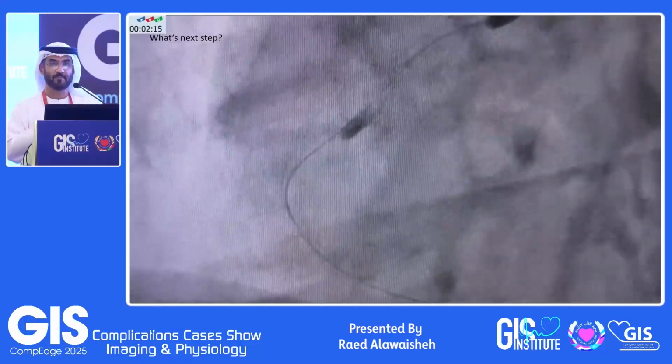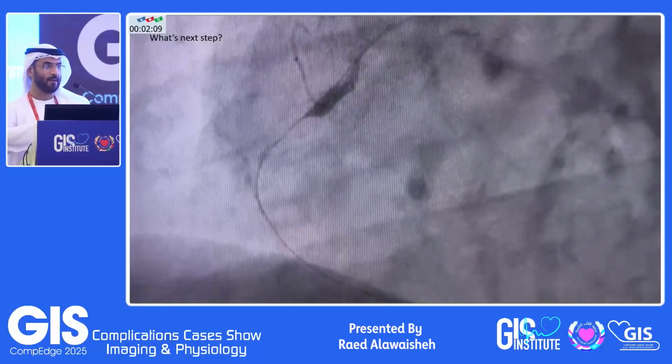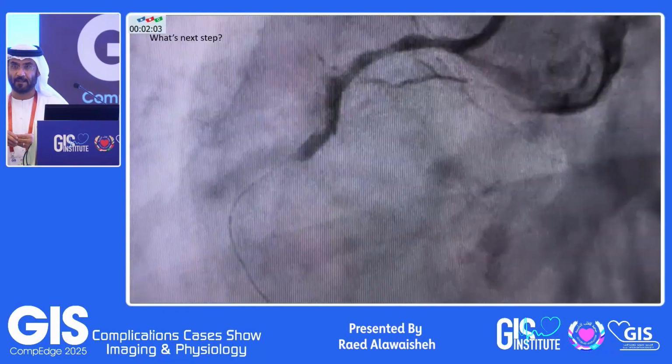Is there any retrograde? No, no retrograde. Just this one. So proximal, just proximal ballooning, Dr. Ahmed. Anybody will do anything else? Wait for a while. Good.